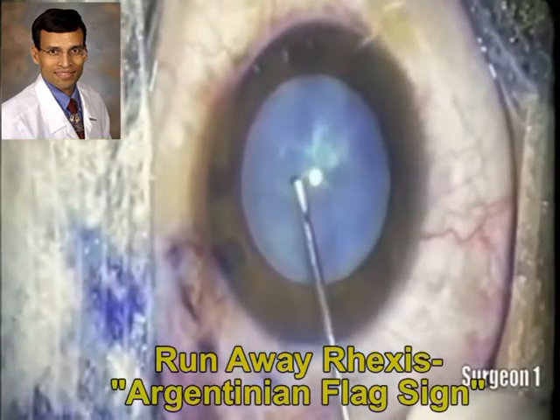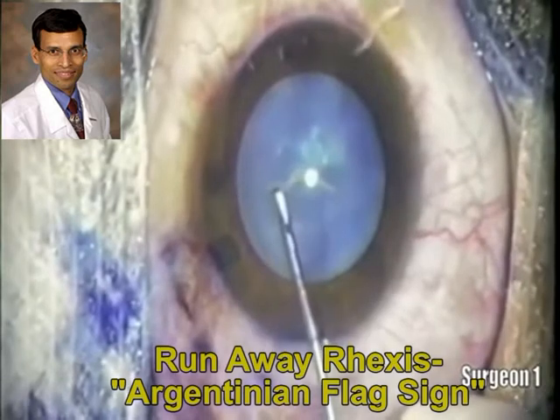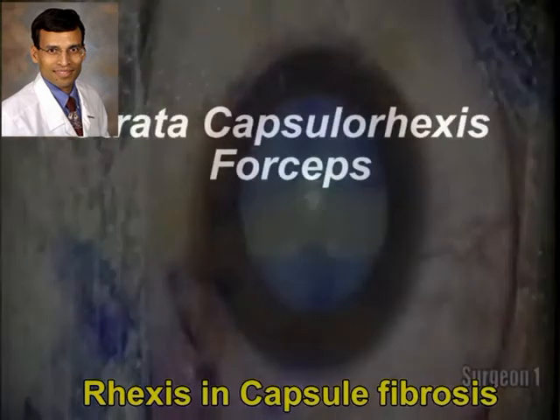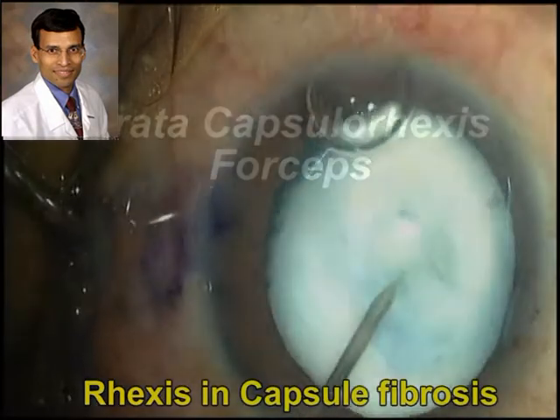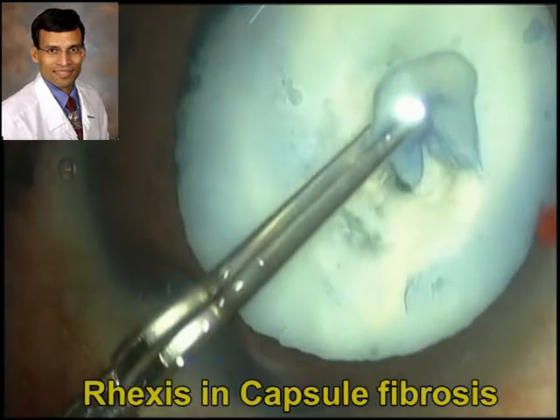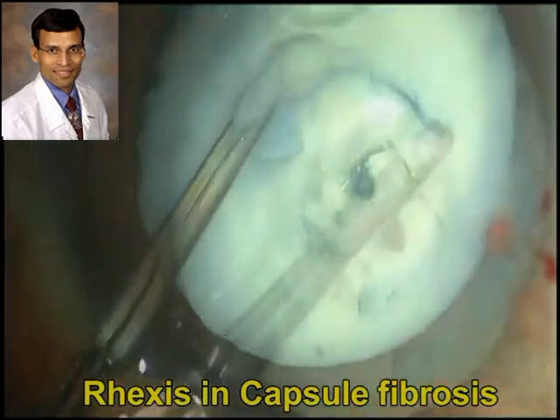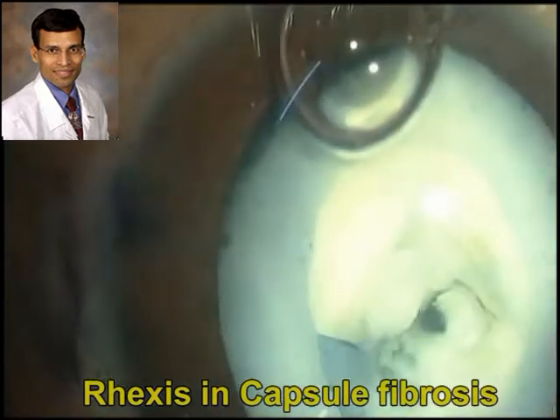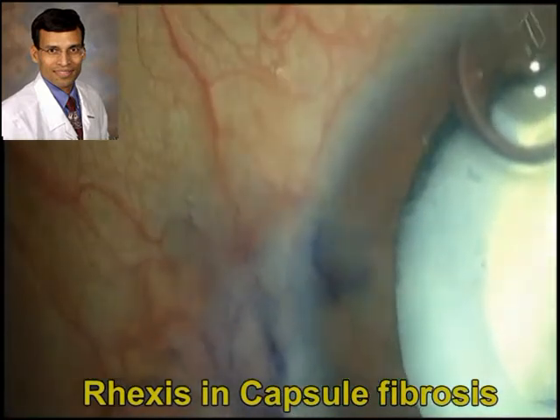In another white cataract, capsulorexis is performed with a capsulotomy forceps, and here we see the Argentinian flag sign, which we are all scared of. Using a Utrata capsulorexis forceps provides slightly greater control, but these forceps depend heavily on surgeon skill and are not uniformly reproducible — the size and position are not perfectly controlled.